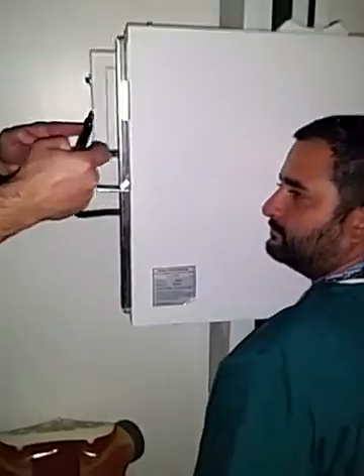No, I don't think so. Okay. I'm going to get in there and look, and let's see. You're correct. He's not. He's rotated, and you can tell he's rotated because here's that mid-sagittal plane. It's closer to the IR than it is out here. Sorry, man. That's a little better.